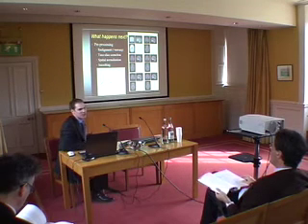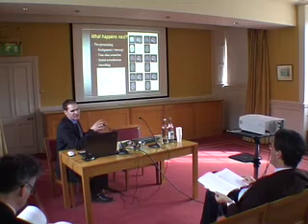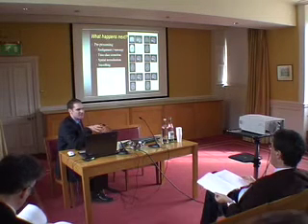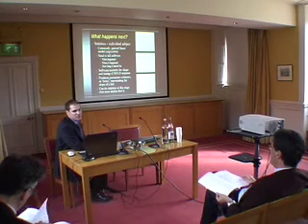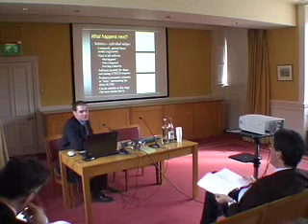So that's the pre-processing, and no, we haven't done any statistics yet, so we haven't tried to make any inference. All we've done is tried to make our brains all in the same space, within each subject, and then all in the same space between the subjects. And then what we do is actually simple correlation analyses. So we really do simple regression.